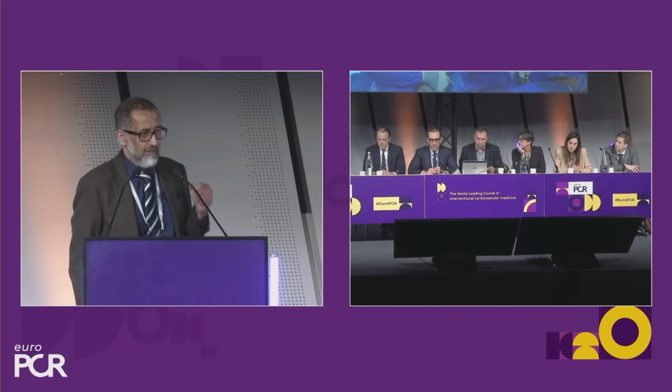No, I think if we're putting a very large valve in, then we want the maximum control the first time. If, in fact, I'm seeing there's a lot of ectopics, and I've had cases where the ventricle is just very irritable, then I need to control that because I just don't have a stable platform. And so those are the two. And if the valve is actually moving up and down a lot, then creating stability by pacing probably at about 120 would be fine.